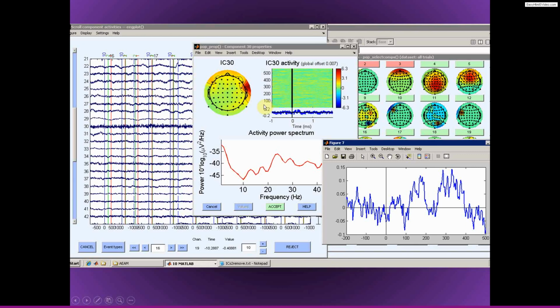It might look really awful and prominent when you see this component isolated, but in fact, it's not really accounting for a lot of variance. So usually I don't even remove components after the first 20 or so, because I mostly just ignore them unless they seem to be particularly awful, just because it's not going to make much of a difference either way.